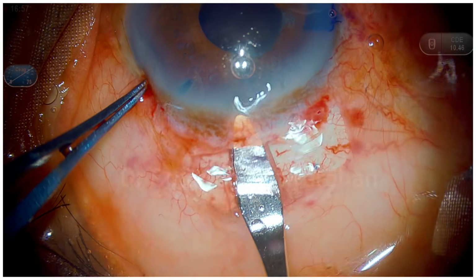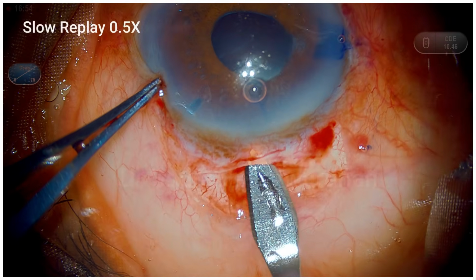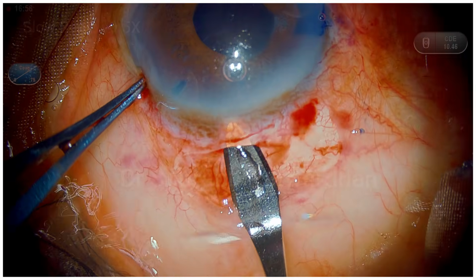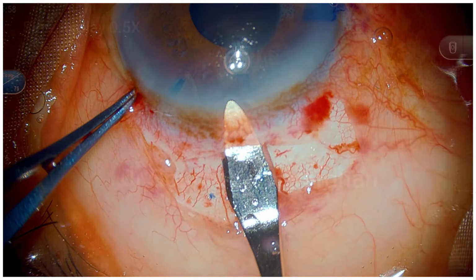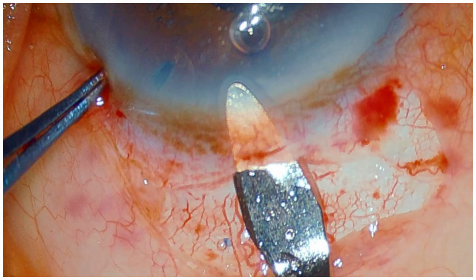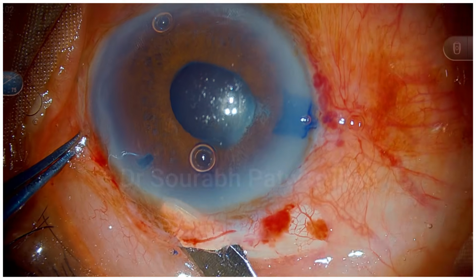So here I want to show how to make a scleral tunnel. So after the first groove, I have made that tunnel. You have to watch how the sclera looks, or how the blade looks through the sclera. It has to be just visible. If it is not visible, you are too deep, and if it is easily visible, you are too shallow. So this is the end point of creating the first pass through the sclera and into the cornea.